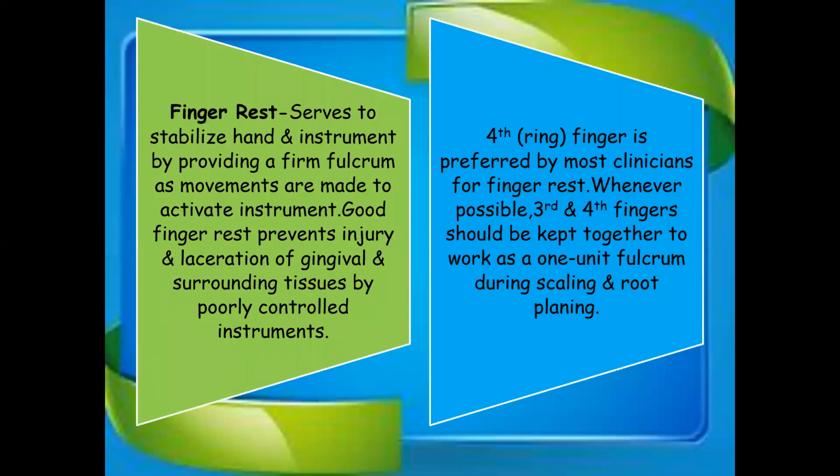So coming on to finger rest. Finger rest serves to stabilize the hand and instrument by providing a firm fulcrum as movements are made to activate the instrument. Good finger rest prevents injury and laceration of the gingiva and surrounding tissue by poorly controlled instruments. Mostly we use the fourth finger for finger rest. Whenever possible, third and fourth fingers should be kept together to work as one unit fulcrum during scaling and root planing.